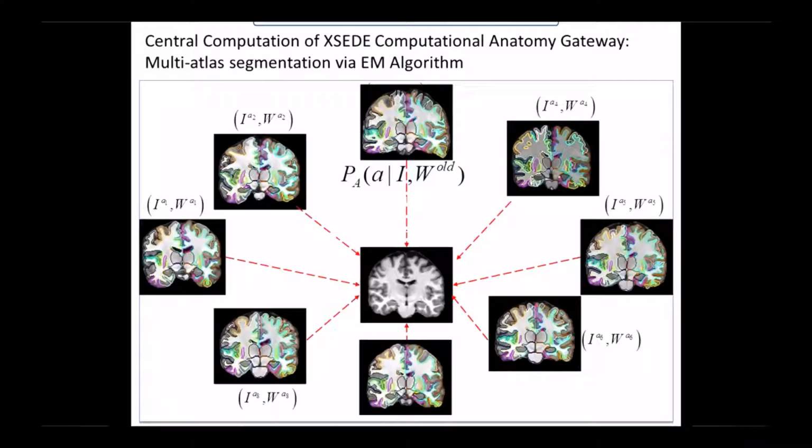The next thing we need to do is then apply the content in those atlases. Those are like the training records. Every radiologist, when they get trained in a particular area of the brain, they have training data, particular clinical cases that have been annotated that they learn from. And we're creating these atlases for the machine to have. So the next thing we need to do is to apply the knowledge that's stored in those atlases to individual MR images that come in from the cloud user.